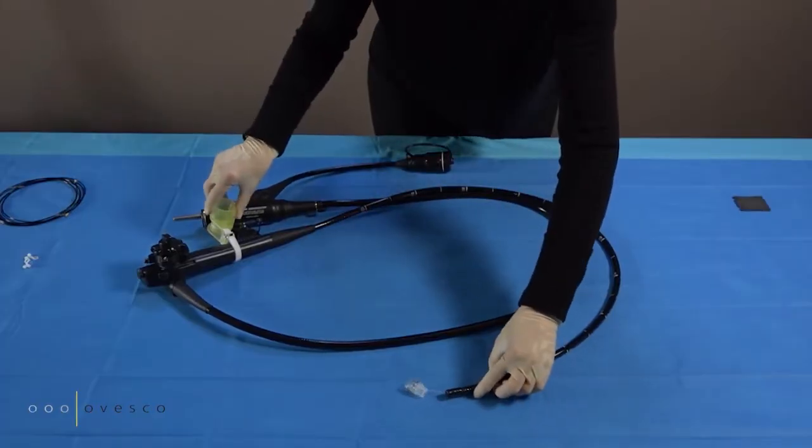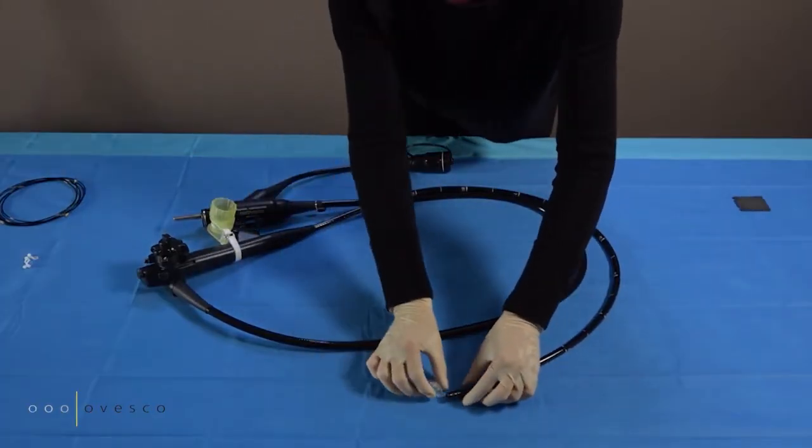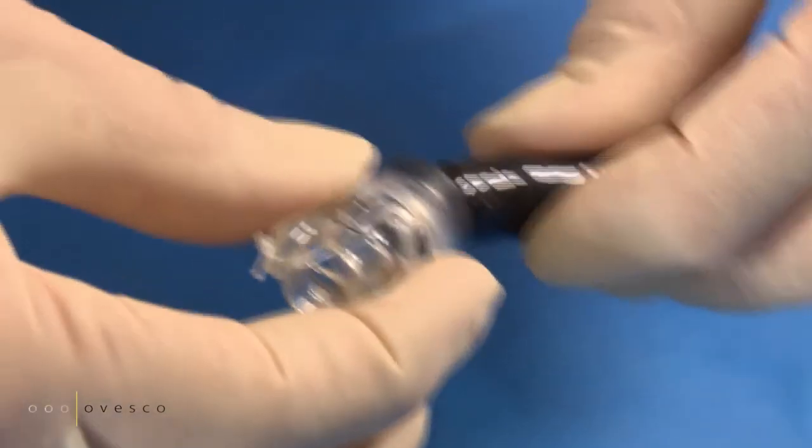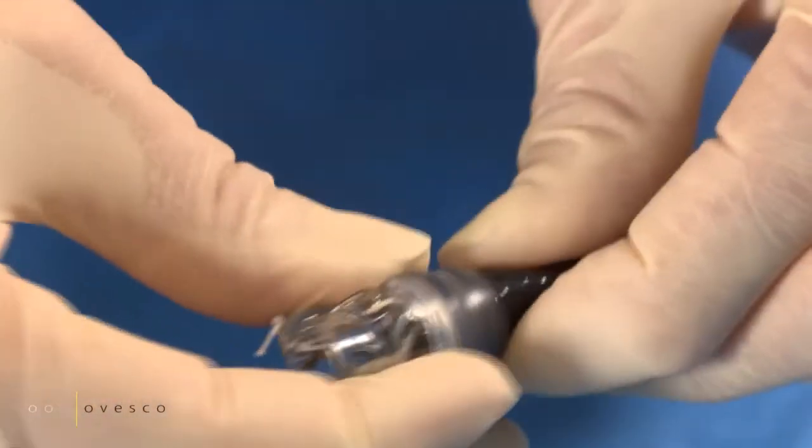Place the cap onto the endoscope. Push the endoscope forward until it reaches the marking.